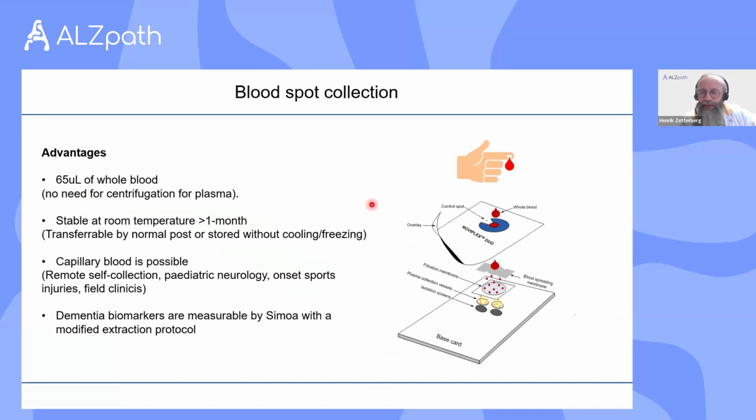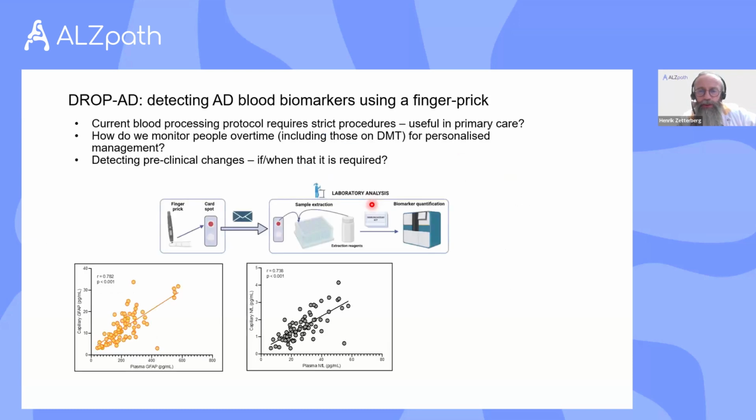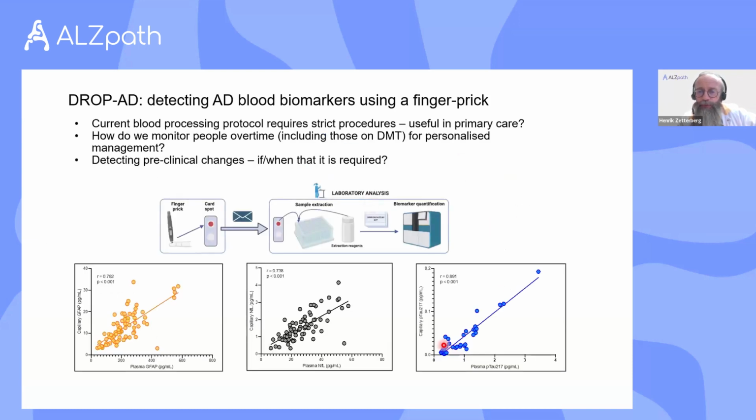One thing to make the biomarkers more available has been also to look at different ways of collecting this plasma. One could say that the regular venous puncture and collection of EDTA plasma is one way forward, but now it also looks like finger prick testing will work. And I think Kai will talk more about this. This is what it looks like for phospho-tau 217 if one looks at finger prick test and collection of a dried plasma spot compared with regular plasma phospho-tau 217: a nice correlation. The absolute concentration is different, but the correlation is there.